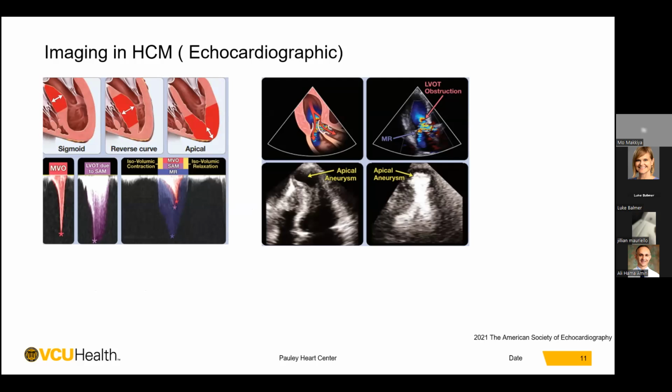It helps to evaluate the myocardial function and to establish the severity of LVOT obstruction, where significant obstruction is diagnosed when the LVOT gradient is greater than or equal to 30 mmHg at rest or 50 mmHg with provocable maneuvers like Valsalva, exercise, or giving amyl nitrite.